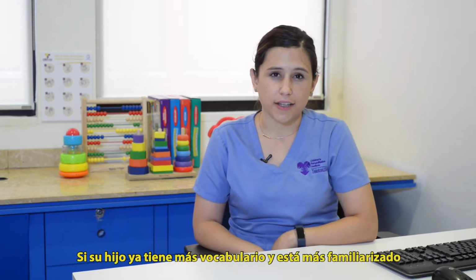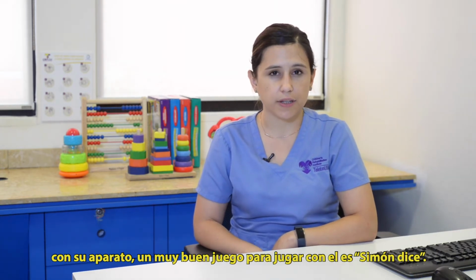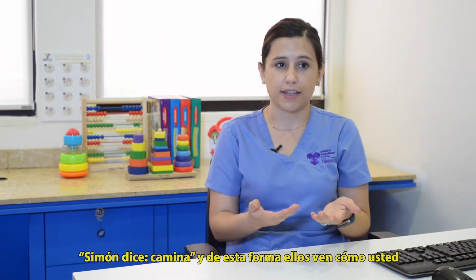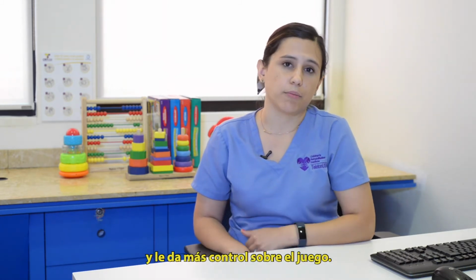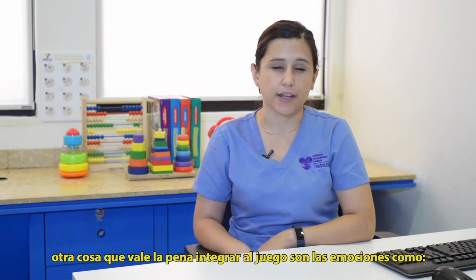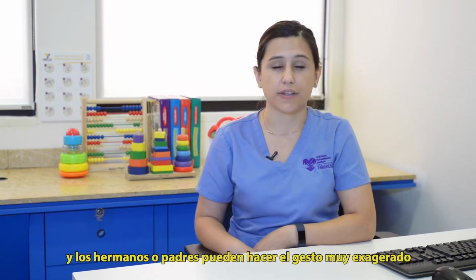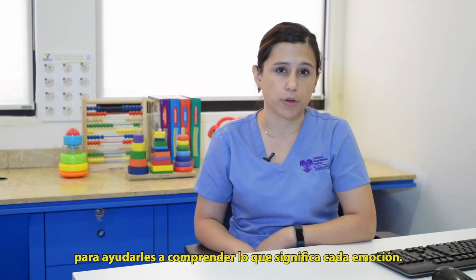If your child has access to more vocabulary and is familiar with navigating their device, then a really good game to play is Simon Says. So you can start with things that are very simple. Simon says go, Simon says walk, and that way they get to see you act out the verb, which helps them understand what the verb means, and it gives them the control of the game. Once they start getting the hang of that, another good thing to integrate into Simon Says is something like Simon says happy, Simon says sad, where the parent or the sibling can make really exaggerated emotion faces to help them understand what those emotions mean.